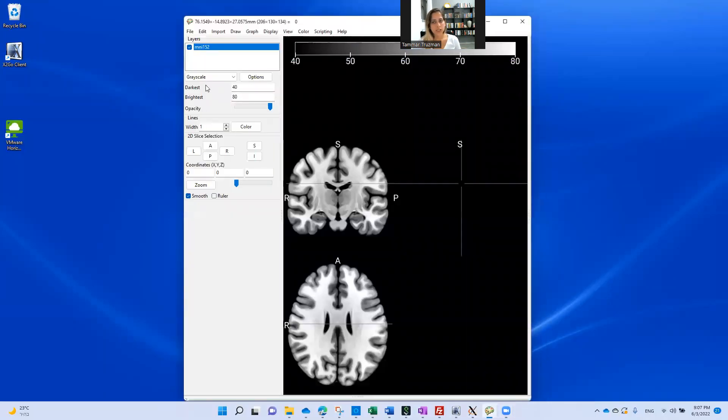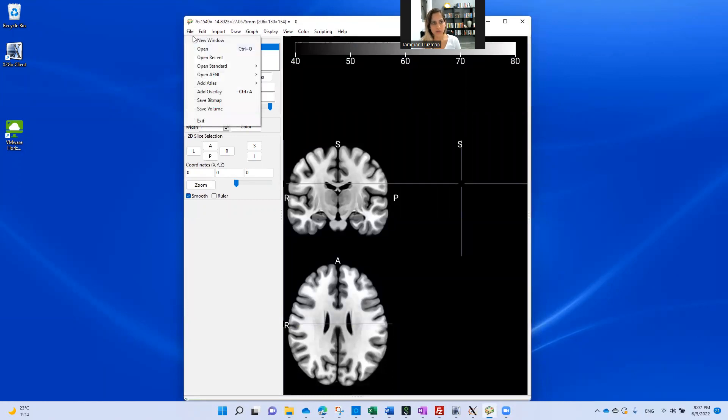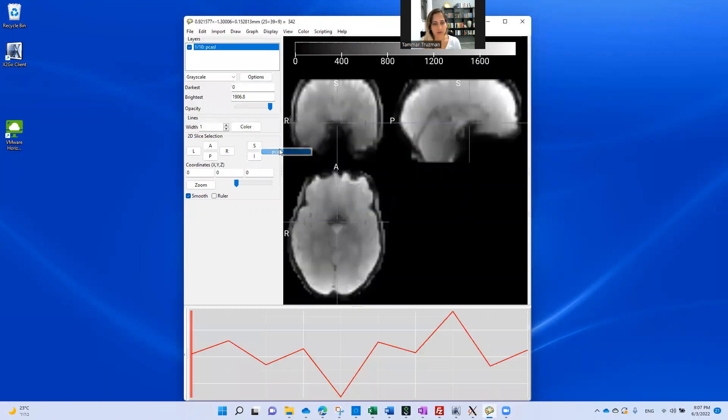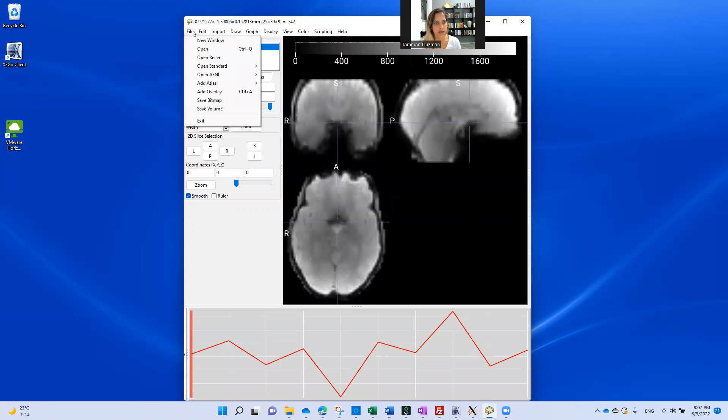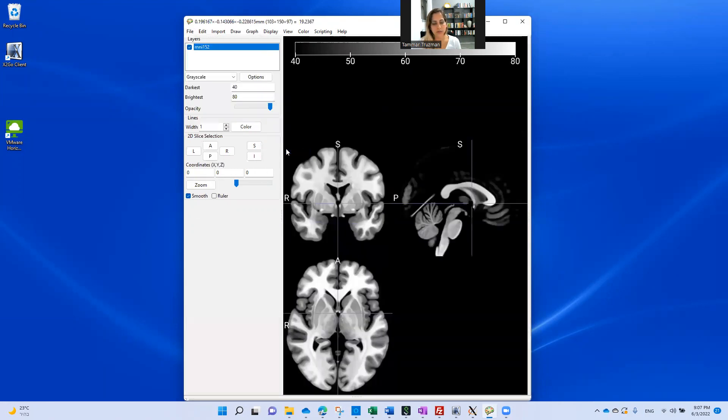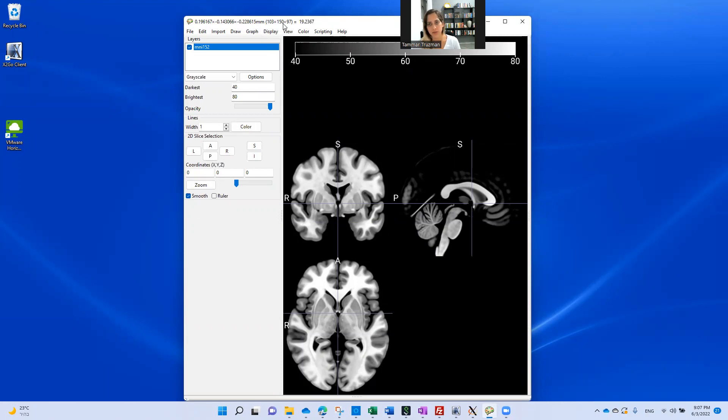First I have to load a background image. For example, I choose here the MNI 152. Now you can see the values here are related to the XYZ dimensions in millimeters as well as in number of voxels.